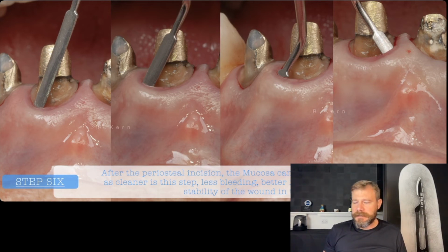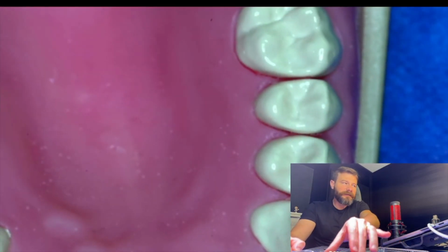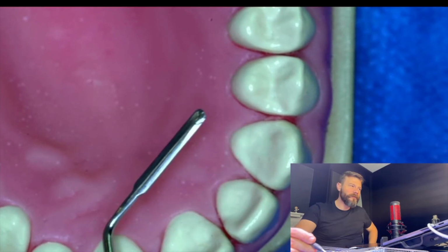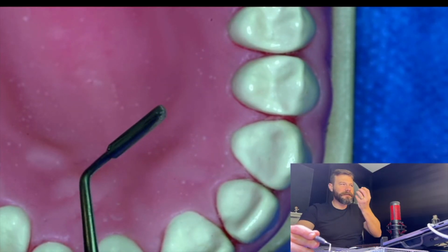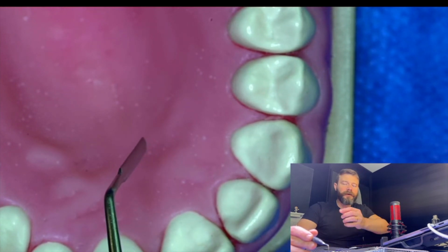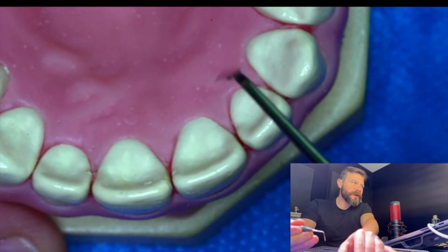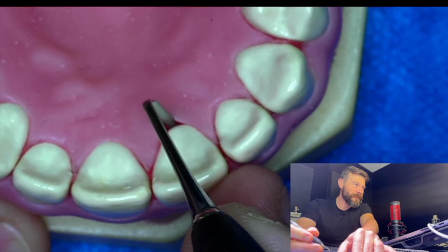That is the sequence, the instrument number 5 in our kit. Why was this instrument developed? Let's bring the macro view here. Okay, this instrument seems like a spatula. One side with a single curvature and the other side with a completely opposite curvature. Why is this instrument there? For some reasons. We're going to apply this instrument for many different approaches. The first and simplest one is when you are doing a detachment of the sulcus on any side of your crown.